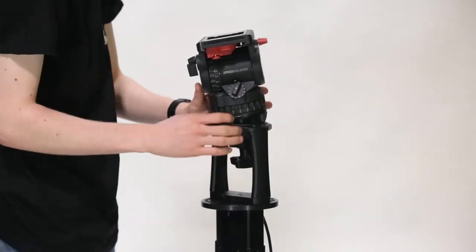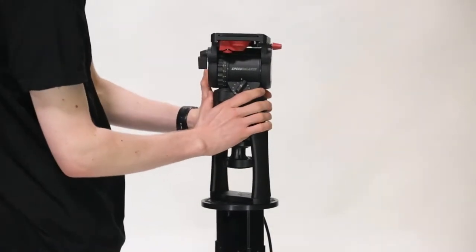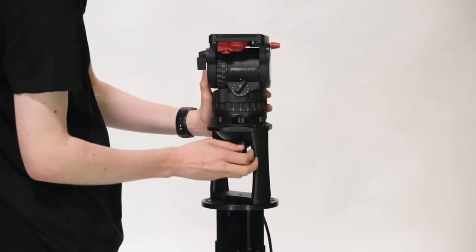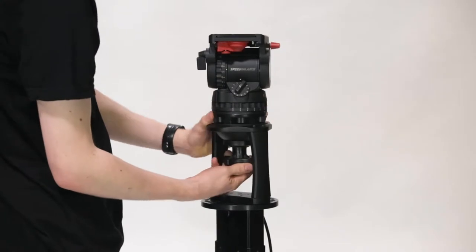Before proceeding any further, level the tripod head so the bubble is fully central, and disable the pan and tilt lock on the head to avoid causing any damage during rigging.